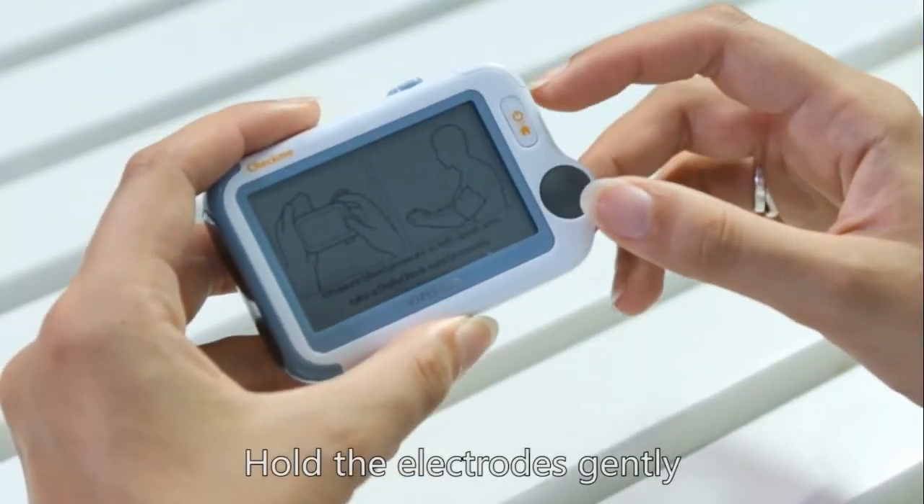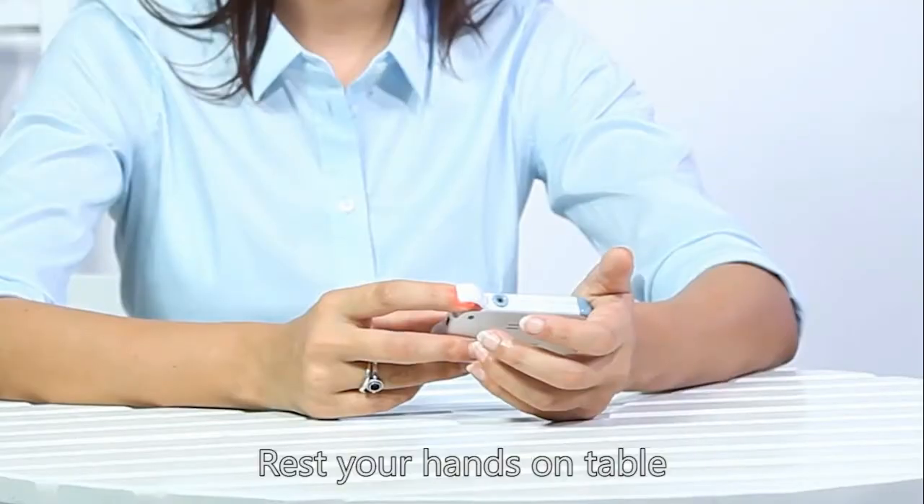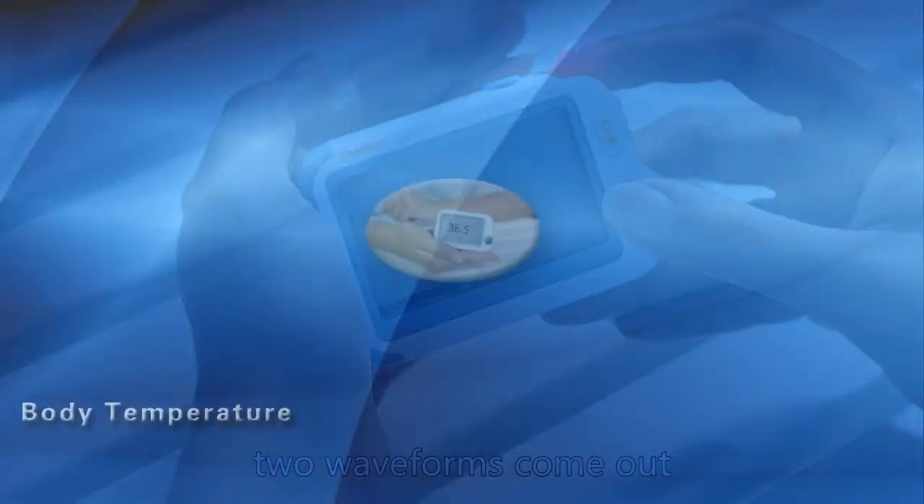Hold the electrodes gently and insert your forefinger into the SpO2 sensor. Rest your hands on the table. A few seconds later, two waveforms come out.